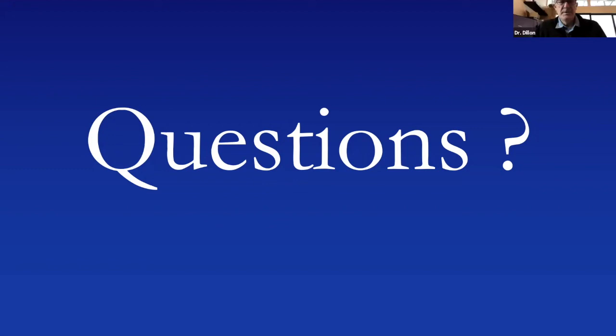There's some other questions in the Q&A box. What are the diffusion characteristics of hydatid cyst in different stages? I wouldn't be able to answer that question. Have you seen that? We don't get a lot of that in the U.S., certainly where we are. I don't recall them offhand. I would not be surprised, though, if at certain stages they did restrict. I think that would make sense with the general pathology of it.